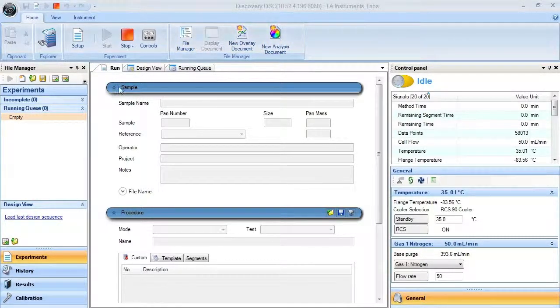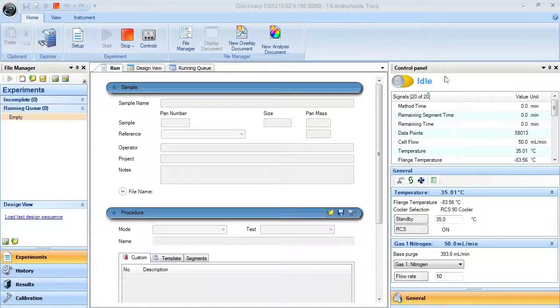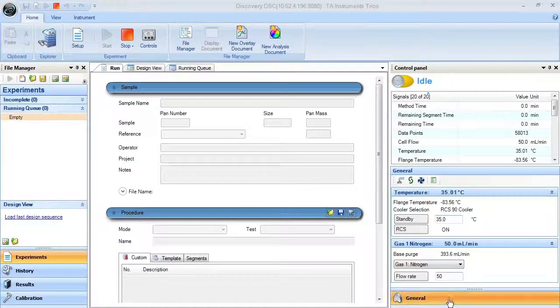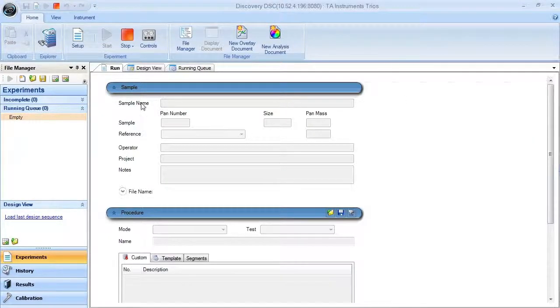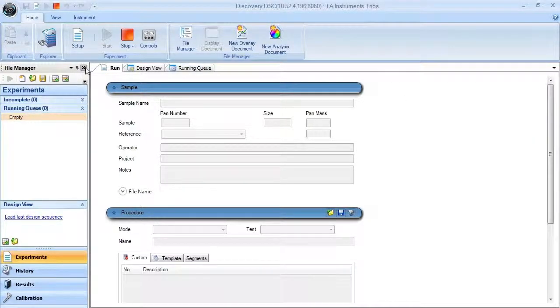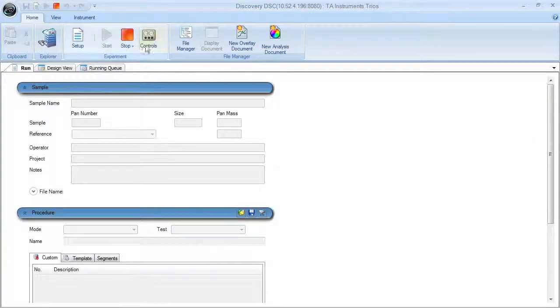the experimental design and run in queue, and the control panel. The file manager and control panel can be closed and reloaded as needed.